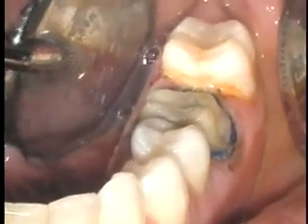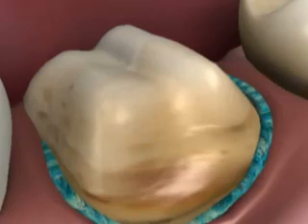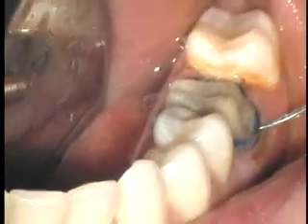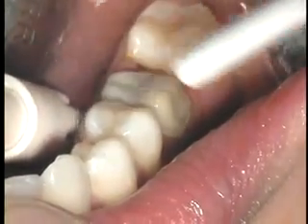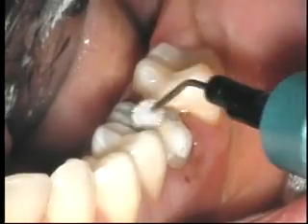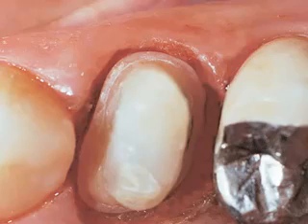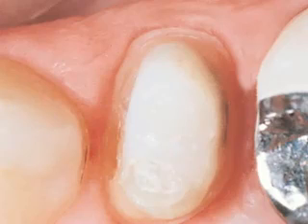After packing, rinse the area. The cords need to be left in place for only one to three minutes rather than the customary 10 to 15 minutes with other materials. Retraction is rapid because hemostasis has already been achieved and no blood is present to dilute the retraction agent. Remove the cord and test for completeness of hemostasis with a firm air-water spray before the impression material is mixed. PrepQuick can be flowed over the preparation to remove the smear layer, reduce surface tension, and give better accuracy in the impression. Notice the clean, highly detailed margins that are possible to achieve using this technique.